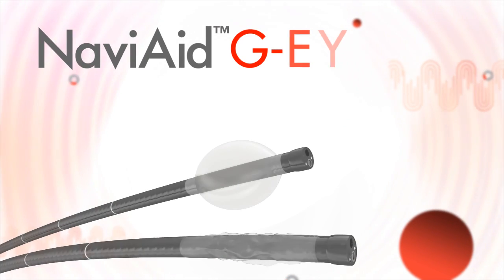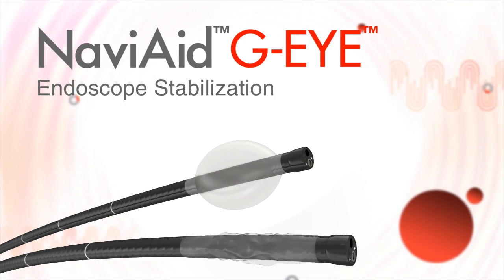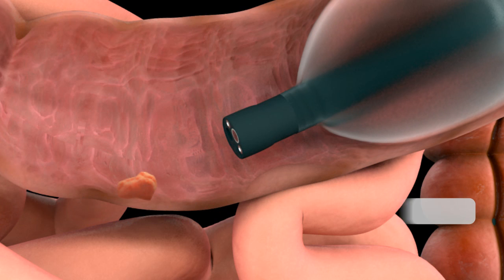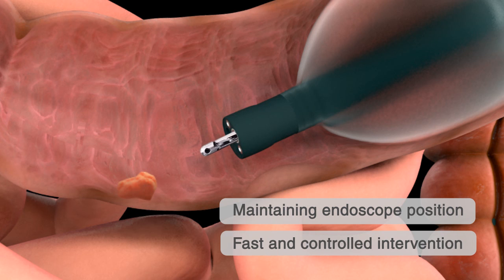Another key attribute of the GI balloon endoscope is endoscope stabilization during interventional sessions. Upon need, the balloon can be inflated to anchoring pressure, thereby stabilizing the endoscope in the desired location and enabling intervention without losing endoscope position.